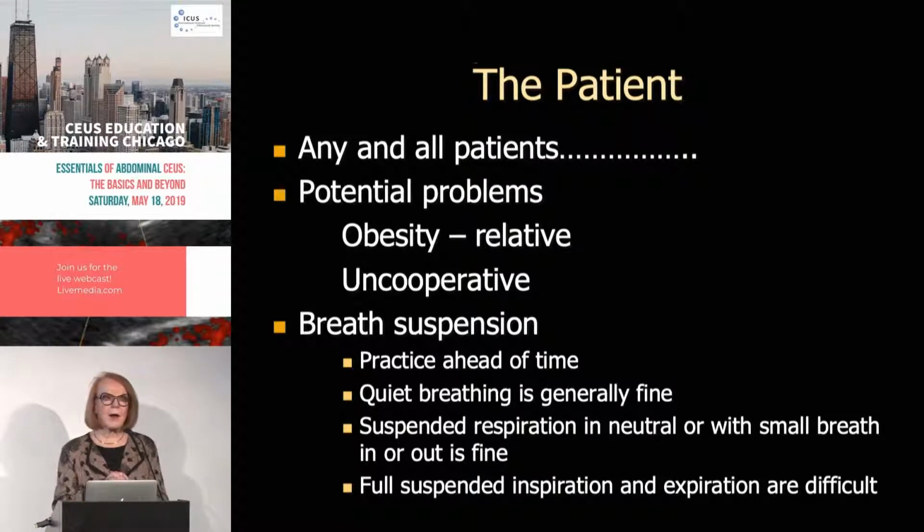And certainly I'm a person who's really madly in love with my sonographers. They just do such a great job for me. They do phenomenal jobs. And when we teach them, I always tell them, spend more time getting ready to do the contrast than doing the contrast. And if you're ready and the patient's ready, it will go perfectly. And if you're not ready and the patient's not ready, it may not. And certainly, suspended respiration in neutral is usually the best.